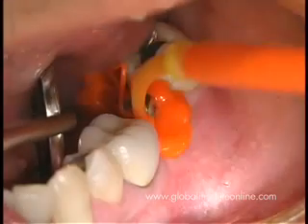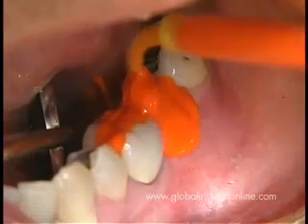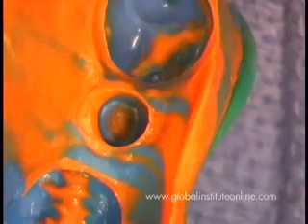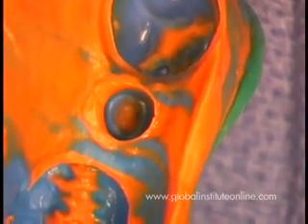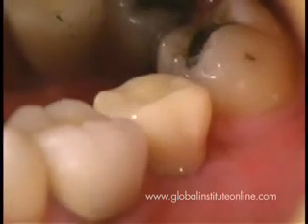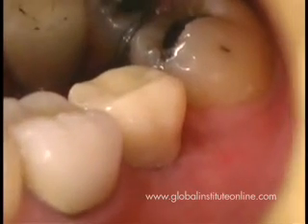Then a light body impression material is being utilized to pick up the margin on the titanium in the same fashion as we would do it in a crown and bridge impression technique, and a heavy body full tray is then being done. Here we can see the impression, the accurate demonstration of the margins of the titanium. And temporary is being placed back, adapted to the site while we're waiting now for the final fabrication.